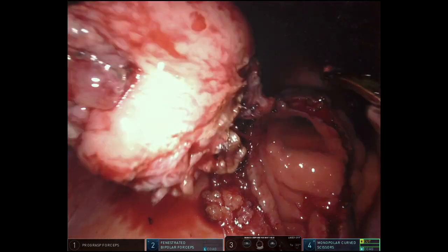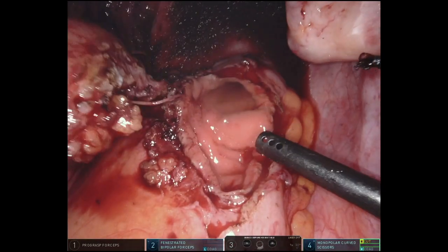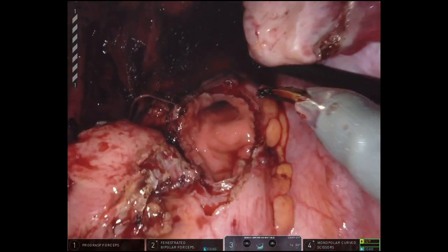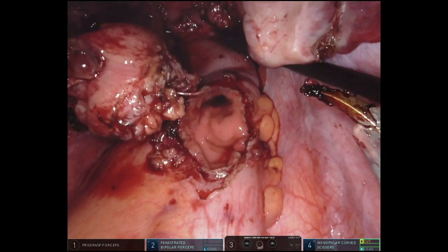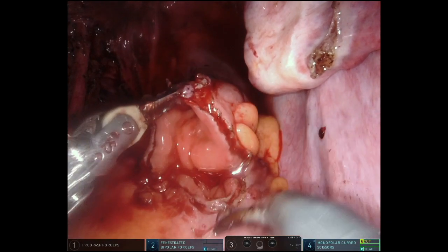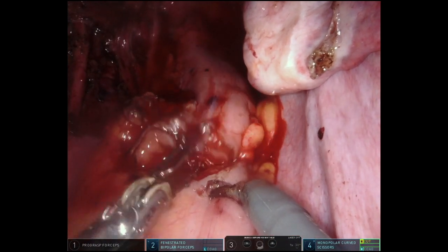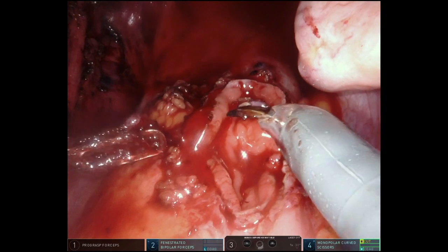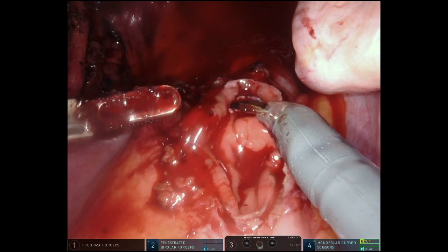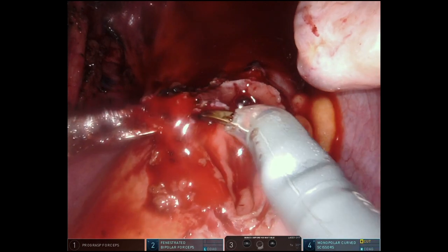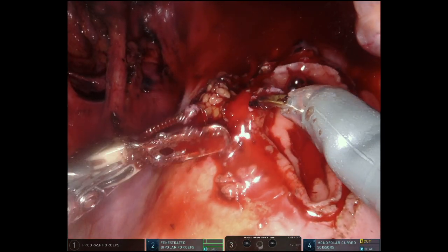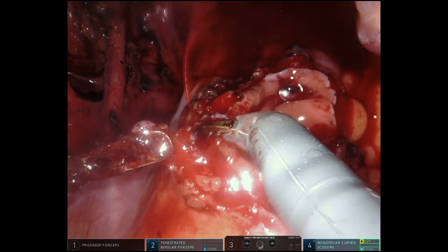With the lesion fully removed, one sees the full defect in the anterior sigmoid, which at times can seem intimidating, but in fact will come together quite nicely with proper suturing technique. One can see that by re-apposing the distal and proximal segments of the anterior wall, one will create a wide lumen with an extended posterior wall. Notably, such a procedure could also be done with a stapler, but as we noticed, it was difficult to reach a stapler high enough to perform this procedure, thus the performance of the suture technique.